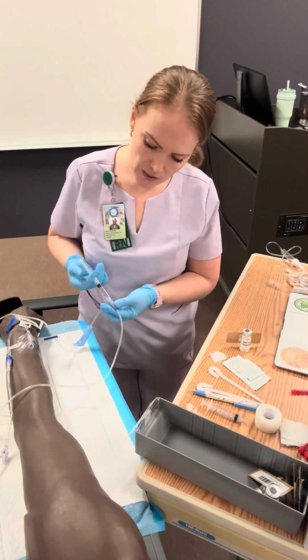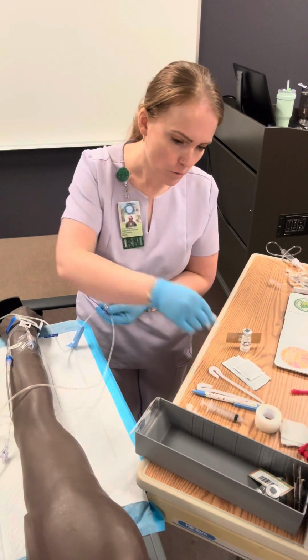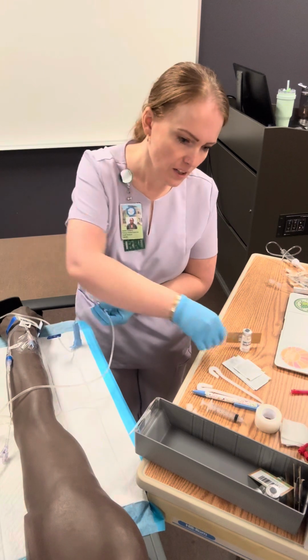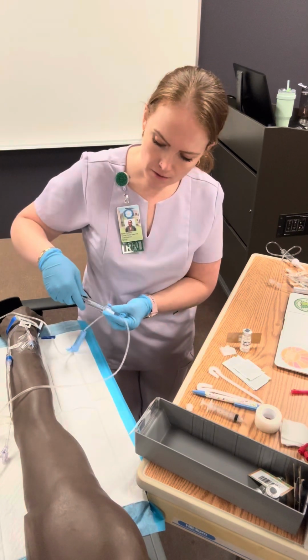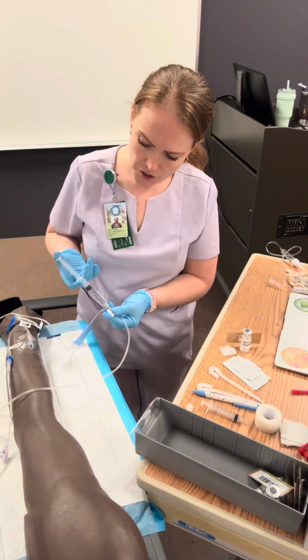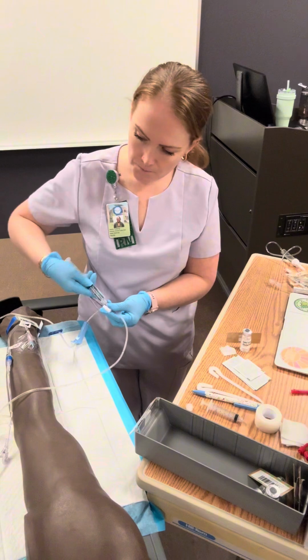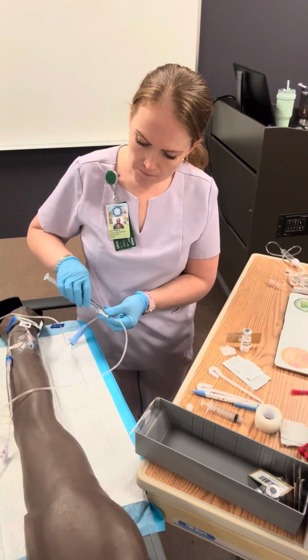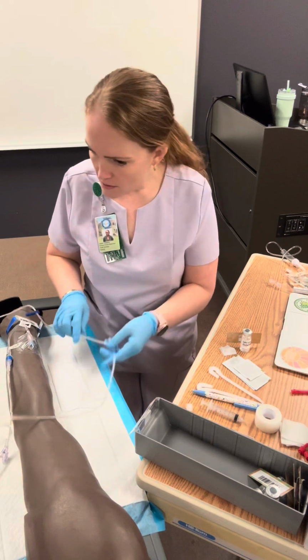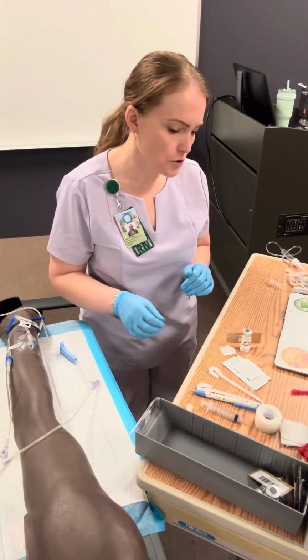And so a minute has passed. I'm going to remove that, clean this again, grab another flush, and flush this at the same rate that I gave that medication. Okay, time has passed. All right, so you should be feeling some of that nausea dissipate here shortly.